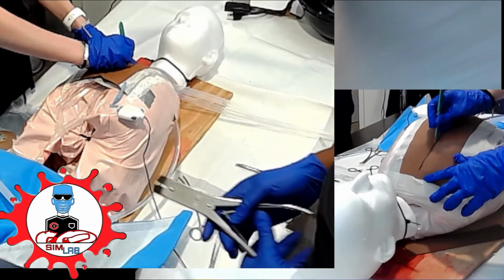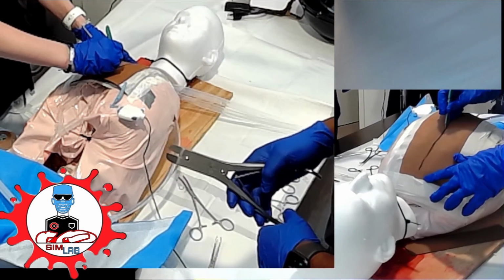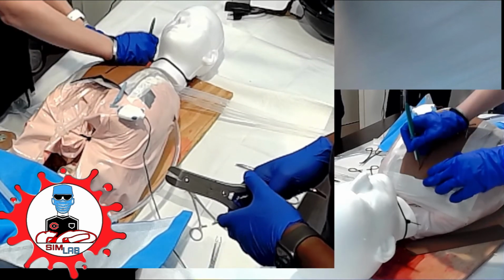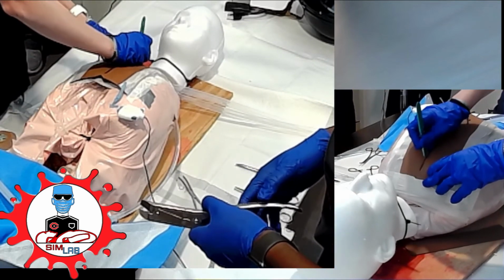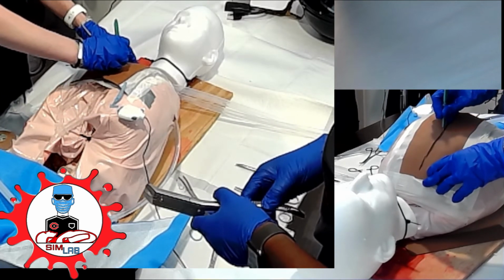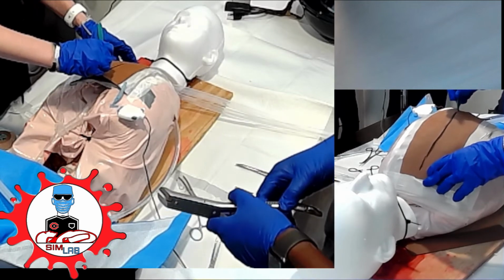You're going to cut down on the midline sternotomy incision, down to the sternum. And be careful, there are wires there. They're from fabric stores.